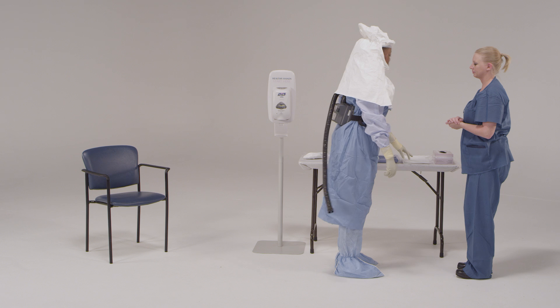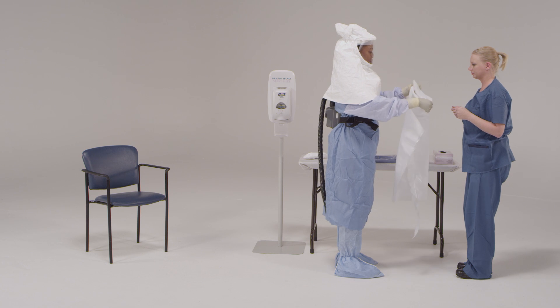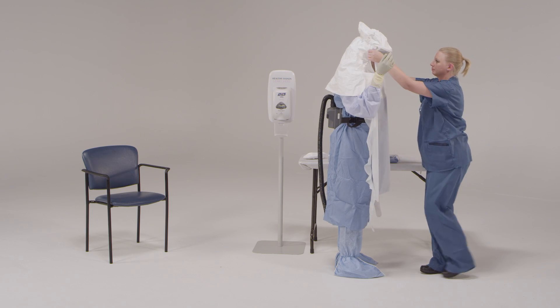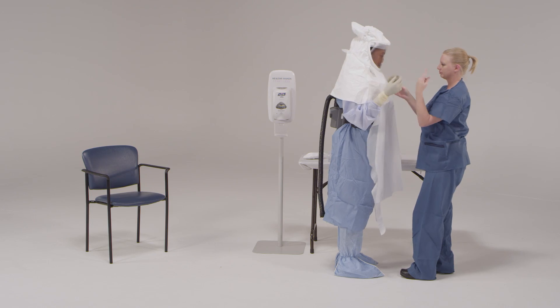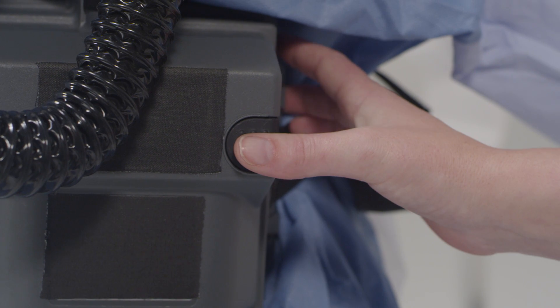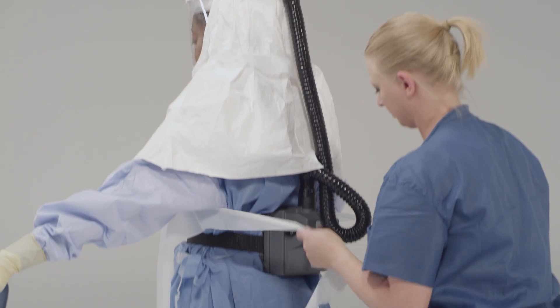If the patient is vomiting or has diarrhea, put on a single-use, fluid-resistant or impermeable apron that covers the torso to the level of the mid-calf. The apron provides an additional layer of protection to the front of the body against exposure to body fluids or excrement from the patient. After the outer apron has been placed over the hood, the trained observer will attach the PAPR tube to the PAPR hood, making sure the tube is snapped and fits, and then turn on the PAPR battery pack and filter unit. If a PAPR unit should stop during patient care, you must leave the patient area immediately.